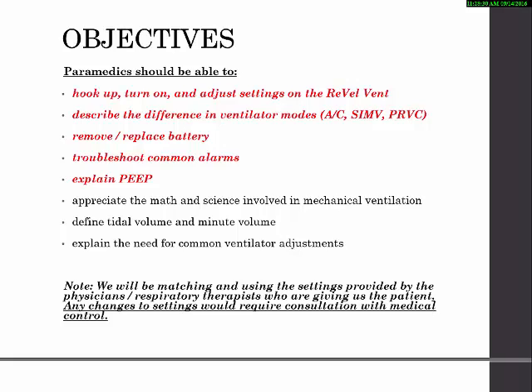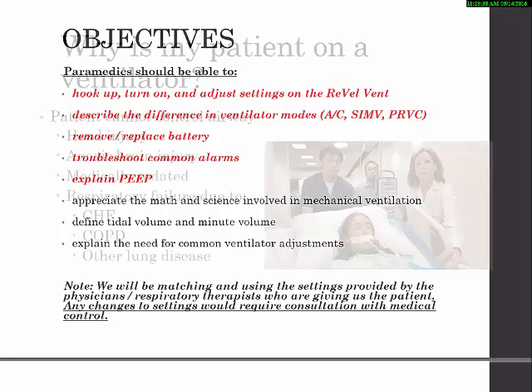You may well understand what is happening, and you may have a very good reason for wanting to change a ventilator adjustment, but if you do that, you are going to call for medical control and make sure that you have permission to do those things.